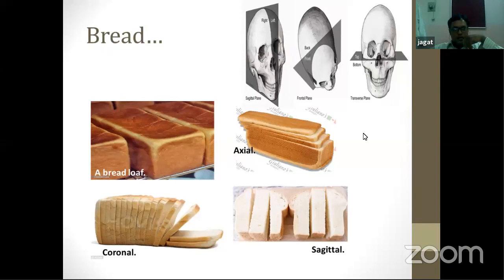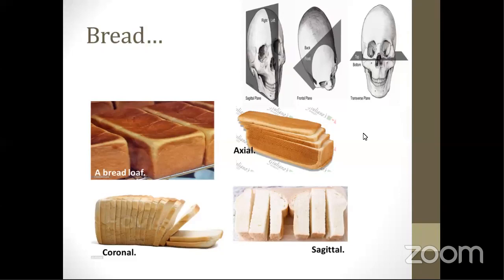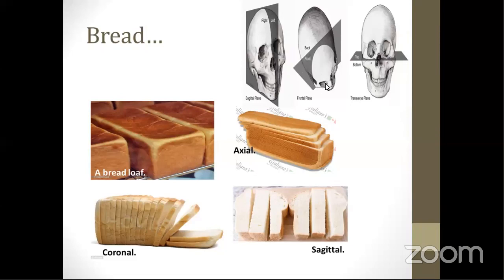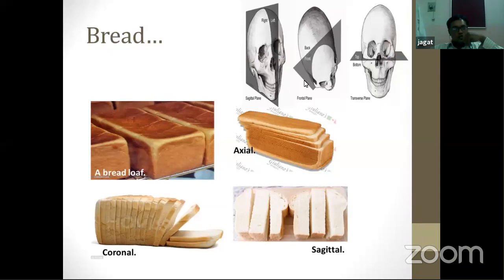Even mathematically, if you want to bring in some calculations, like measuring the distance between point A and point B, it's only possible with accuracy if you have all three dimensions. It's not possible on two-dimensional images. Another problem with two-dimensional images is that they are inherently subject to some amount of magnification. But on CBCT, there is no issue of magnification as such. We have a perfect image, perfect size, perfect value, so your measurements are pinpoint accurate, and you can depend on them without second thoughts.